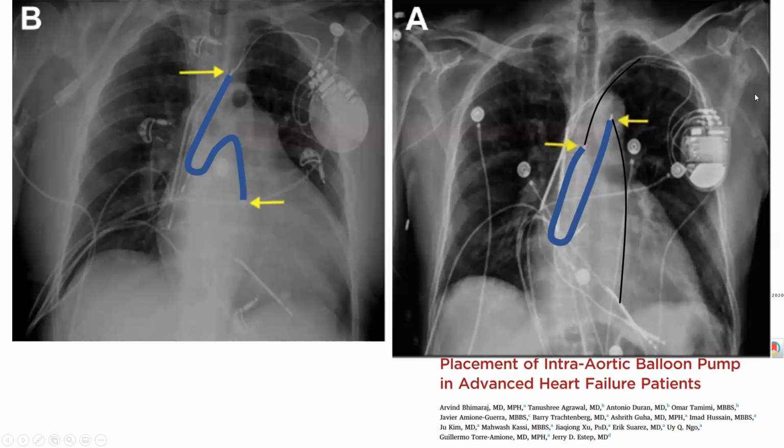Be careful as you're straightening this, as you're advancing a wire in the cath lab to straighten this, you may prolapse it in the LV. So you have to watch for that. And it may actually even prolapse spontaneously in the LV. So that could be a dangerous complication.